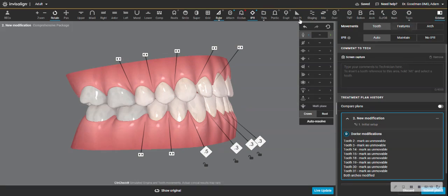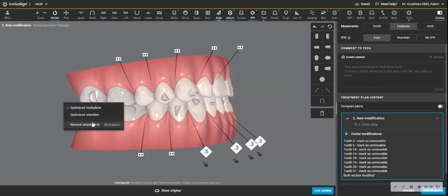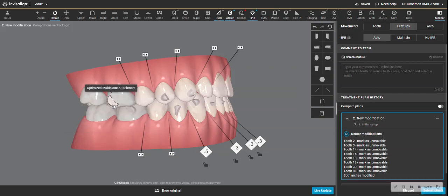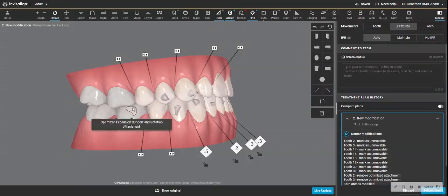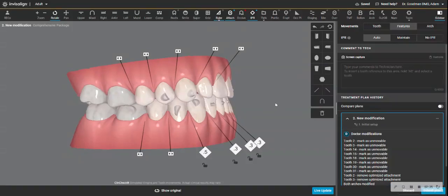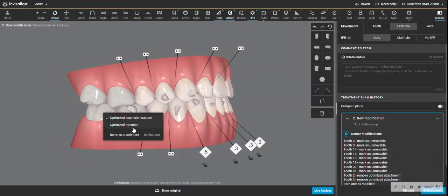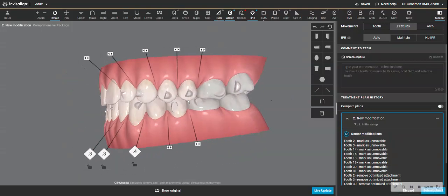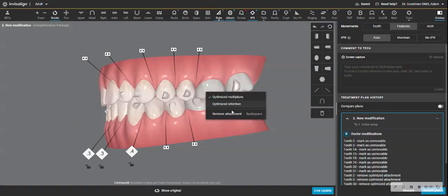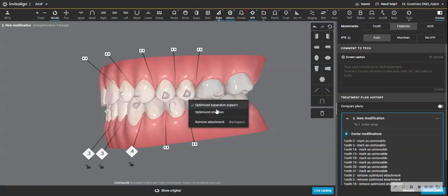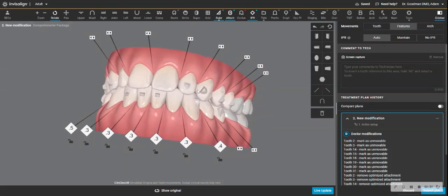I am going to take the attachments off the teeth here. So features, remove attachment on several teeth. Because there's no movement on those teeth and the retention will be fine, as it is with most cases, unless the teeth are really, really short. So I took those off.